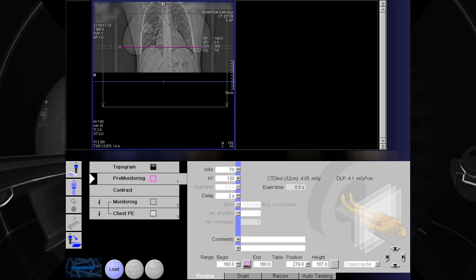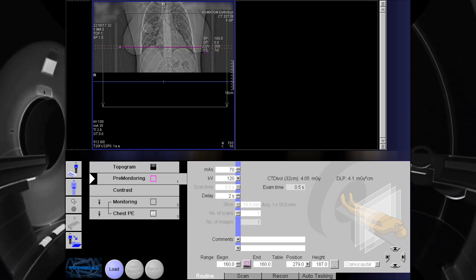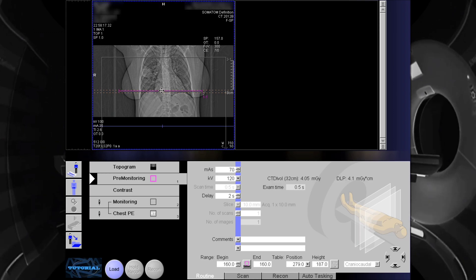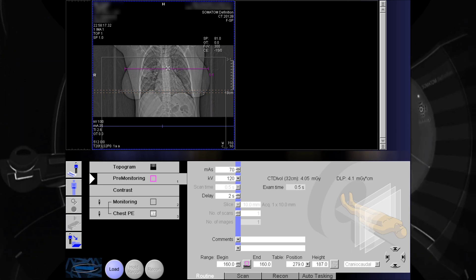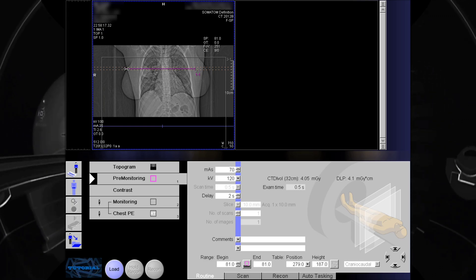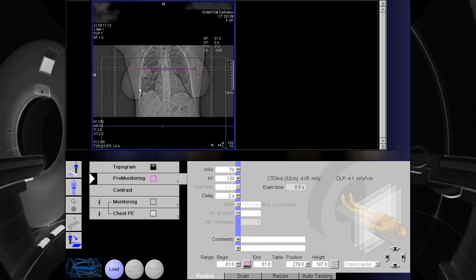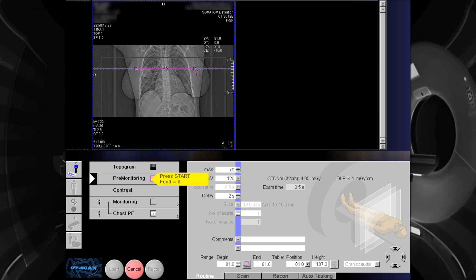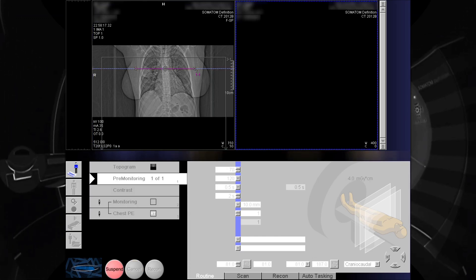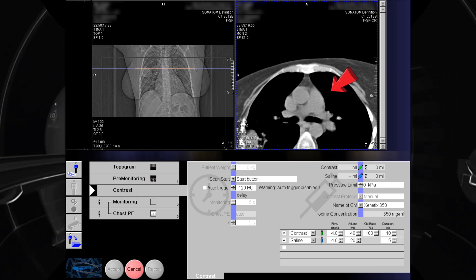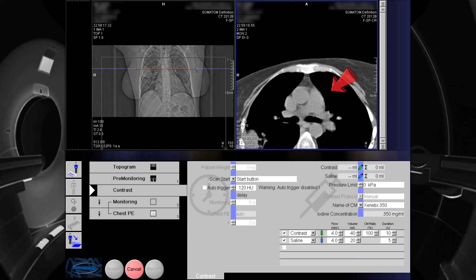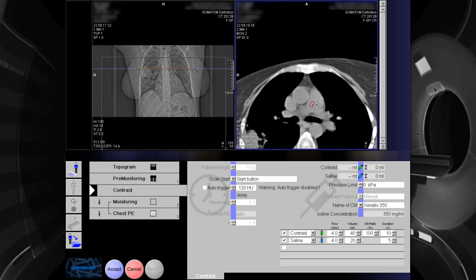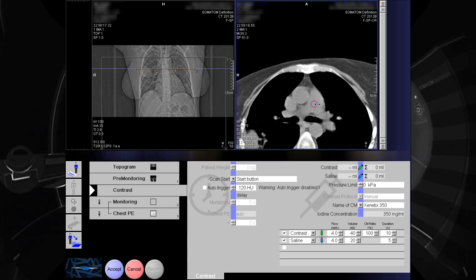Next step is the pre-monitoring. This step is a one-slice acquisition in the region of interest. Place the reference line at the level of the pulmonary artery, located just below the carina. This is our area of interest — we are going to put the trigger in this area. Click on the area to put a marker for the triggering. Make sure that the marker is large enough for accurate calculation of Hounsfield unit.